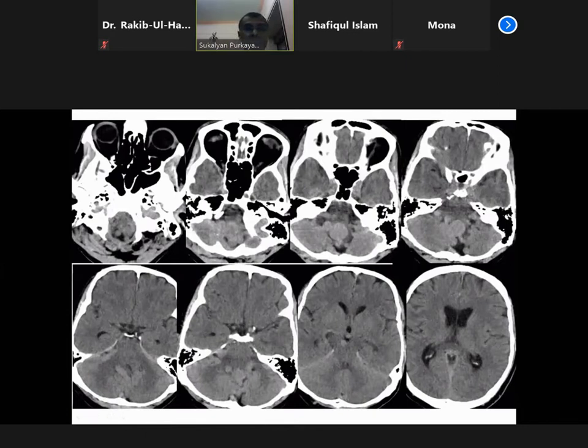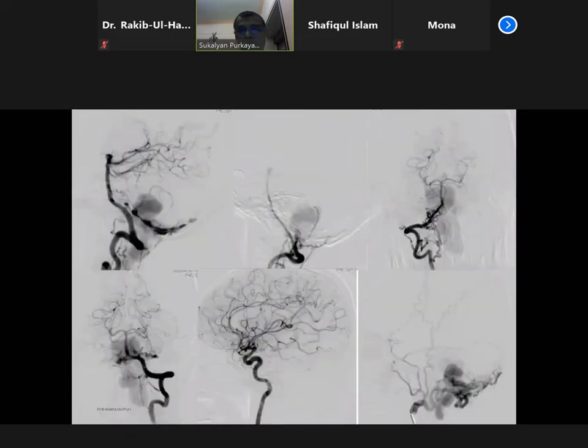Now you can see it, you know how it gets supplied. It usually gets supplied by the occipital artery, the ascending pharyngeal artery, the dural branches of the vertebral artery, and these patients can have perimedullary venous drainage, like in this case, a large venous sac which is dilated and ectatic, and bilateral supply. It may be unilateral, in this case probably this is the right-sided one, but it can get supplied from both sides.